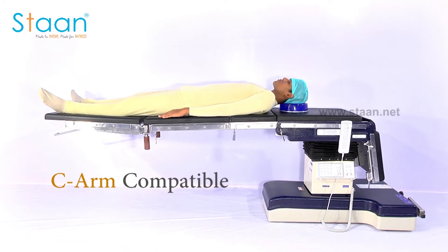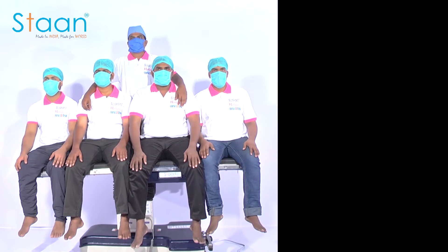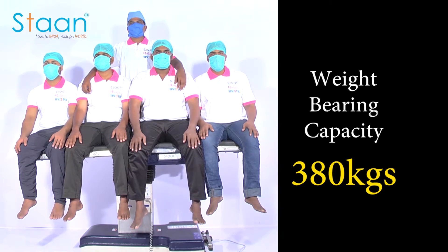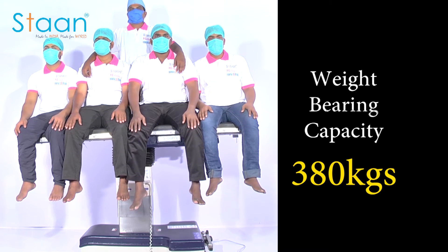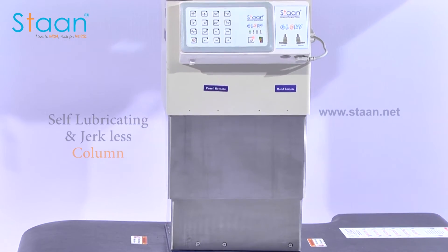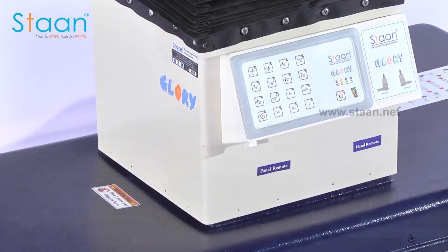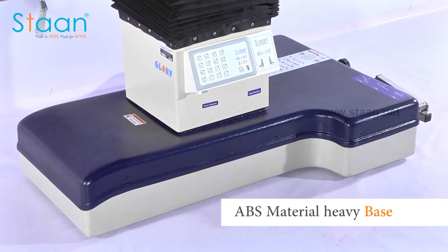Glory is a C-arm compatible dual mode electro-hydraulic table. The weight-bearing capacity is 380 kgs and is suitable for all types of surgeries including ortho, neuro, bariatric, and pediatric surgeries. The column is designed in such a way that it is self-lubricating, jerkless, and has high load-bearing capacity. It has a well counterbalanced base which is entirely sealed by ABS material.